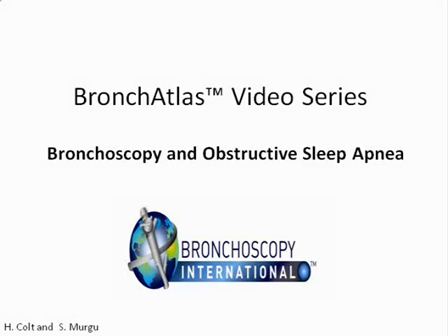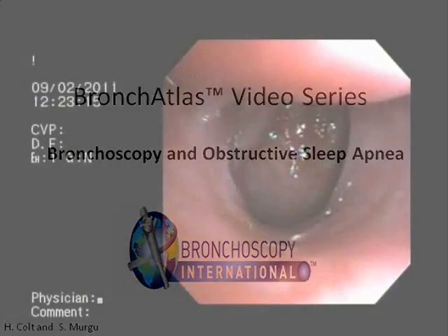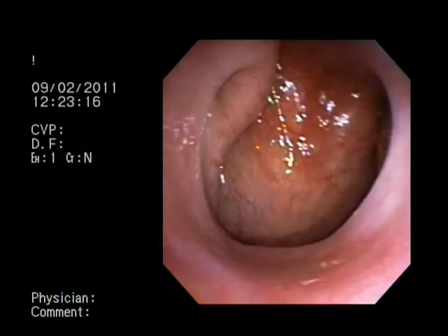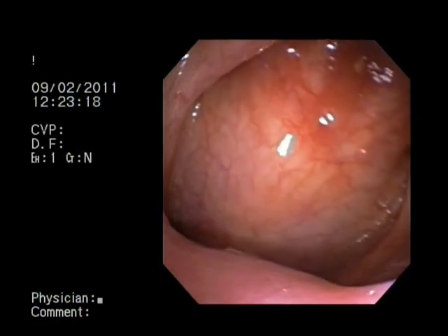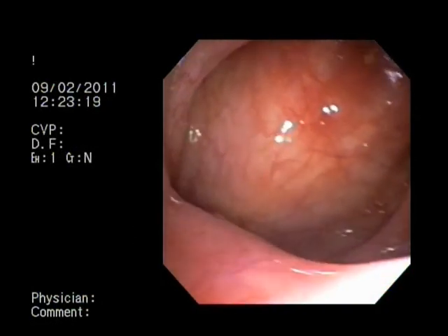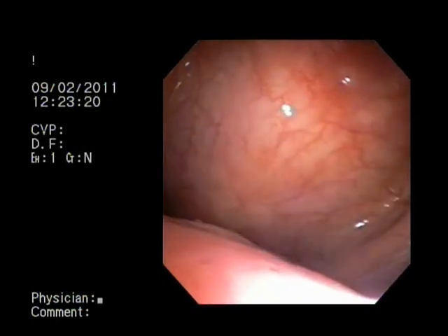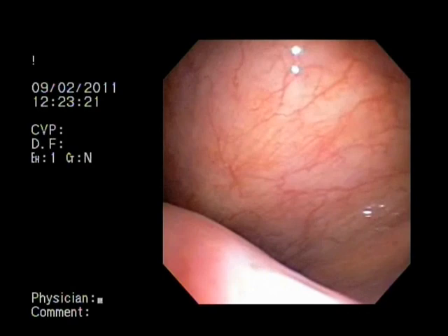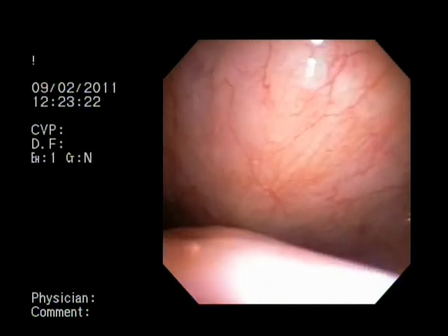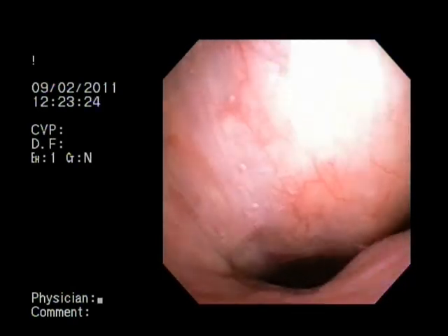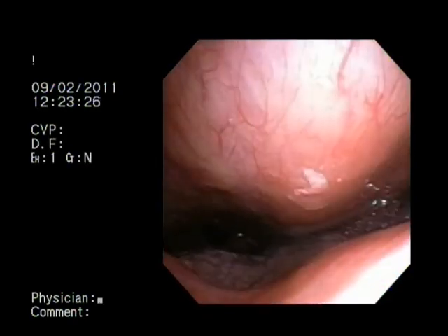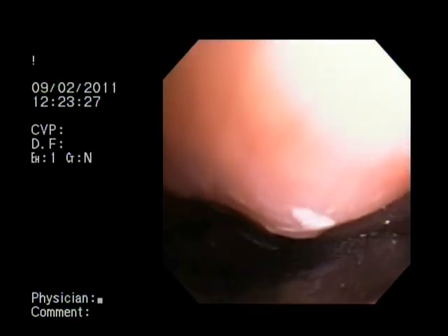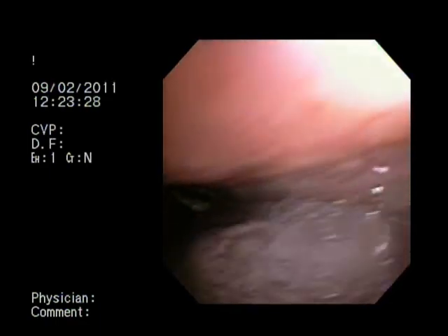This video illustrates the advantages of continuous positive airway pressure during bronchoscopy in patients with obstructive sleep apnea. Redundant tissue can prevent clear visualization of the larynx during flexible bronchoscopy.